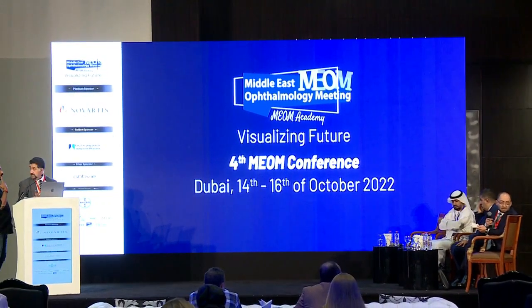That's what I need all the audience to understand: we are changing the time of exposure while fixing the power that we are using, because here you used 30 milliwatt for the thin cornea. Yeah, we are talking about the thin cornea.